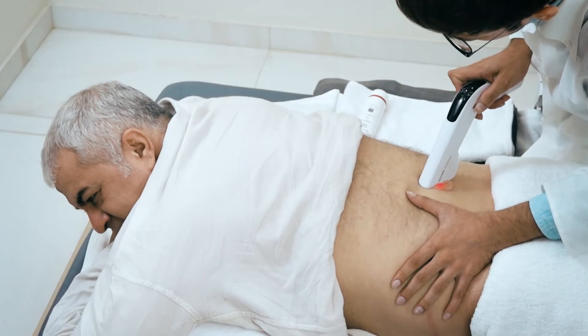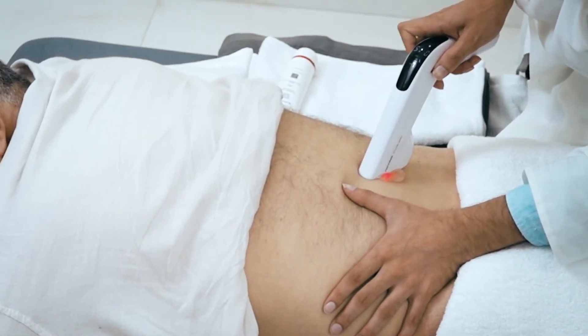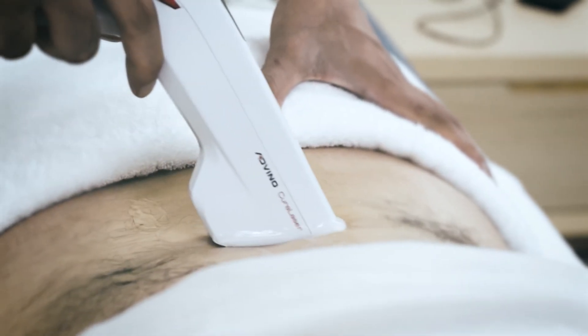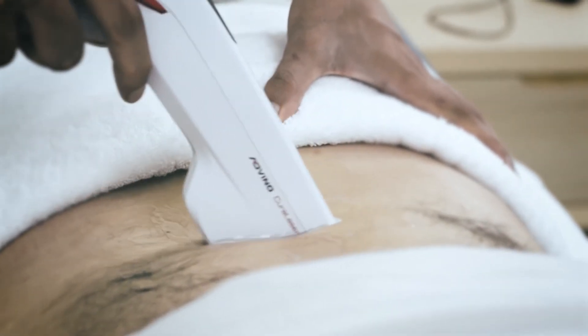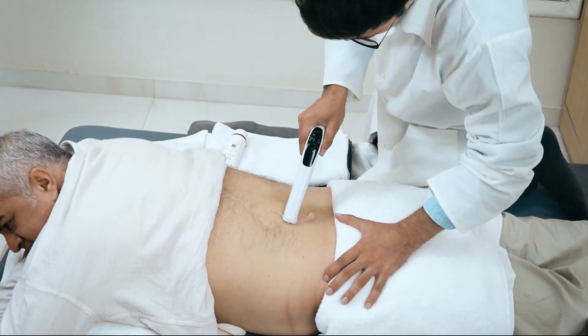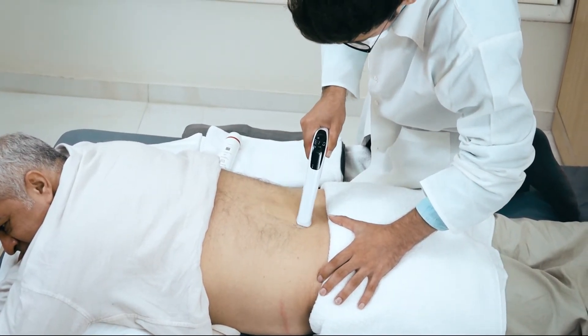Do not keep the intensity too low or too high. Start moving Cura Laser back and forth or in a circular motion over the affected area of the lower back. Keep adjusting the intensity of biostimulation during the entire treatment session to ensure the patient's comfort.